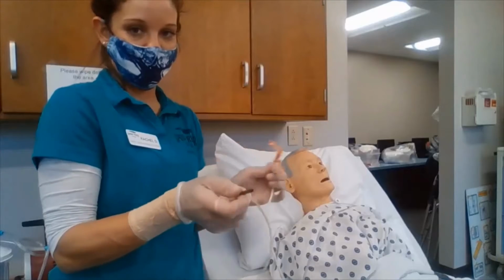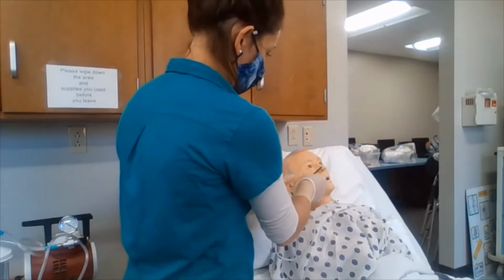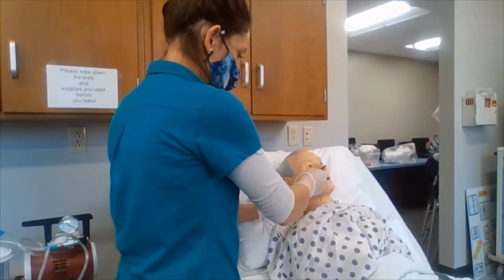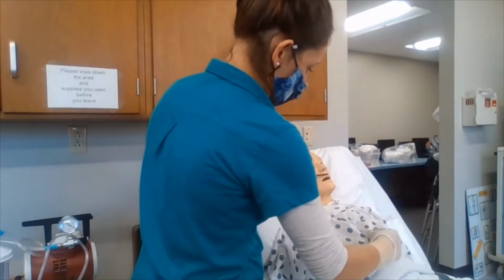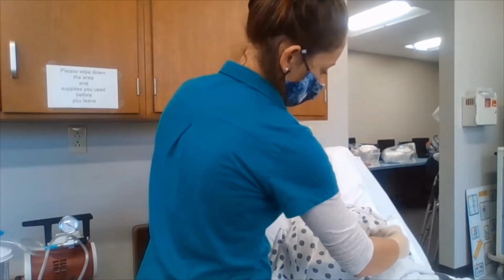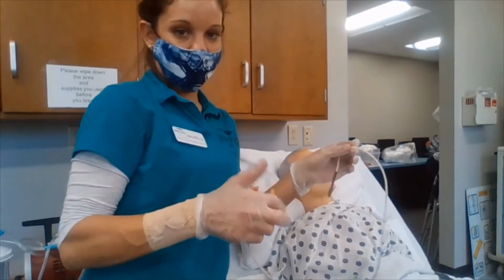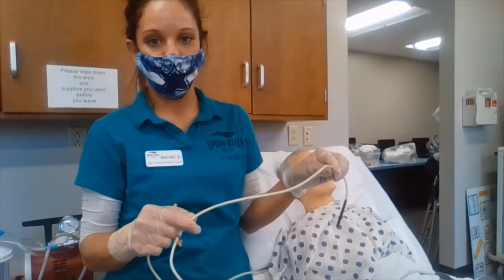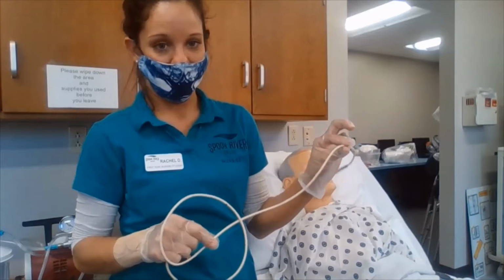When measuring tubing, we are going to start at the tip of the nose to the earlobe, and then from the earlobe to the xiphoid process. And then we are going to make sure that we are marking it with our tape. For an NE tube, we are going to add 4 more inches onto the measurement.